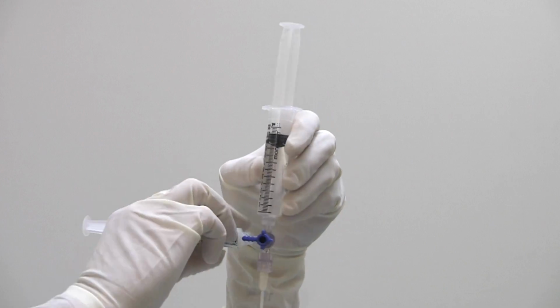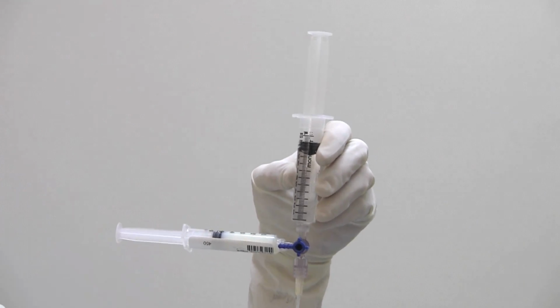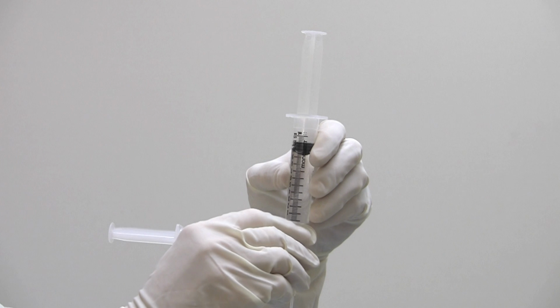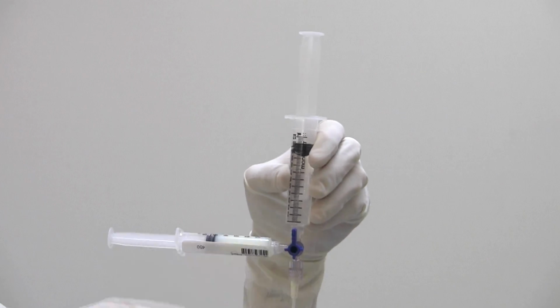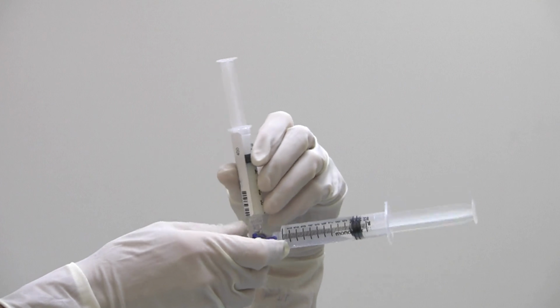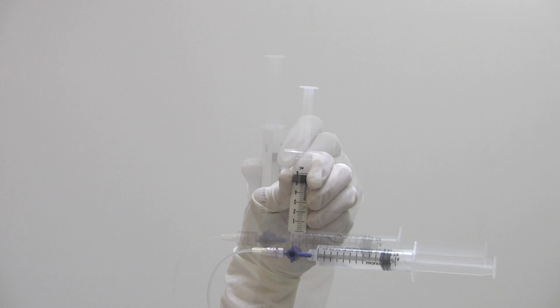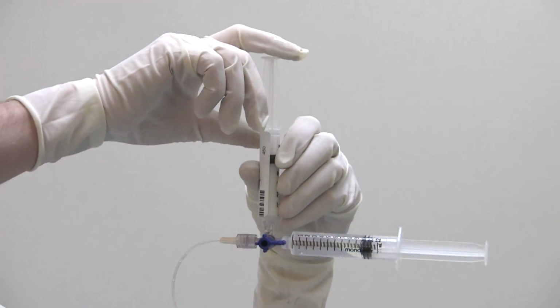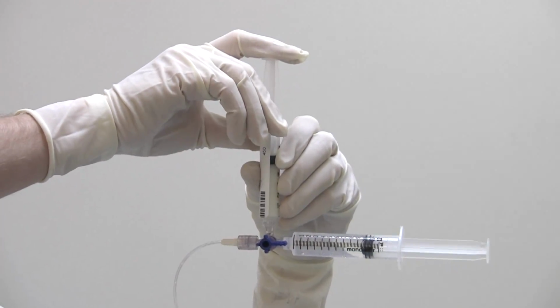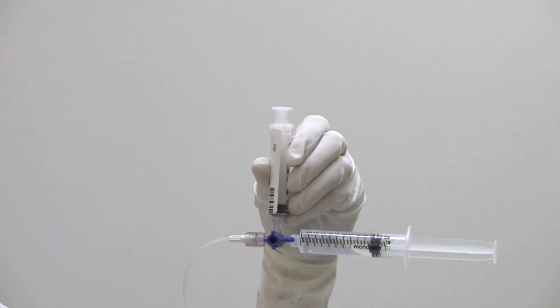With the stopcock in the off position, attach the chemotherapy syringe. Rotate the stopcock so that it is open to the reservoir. Rotate the entire apparatus to reduce air entry into the system. Tap the chemotherapy-containing syringe twice. Administer the chemotherapy slowly over 2 to 3 minutes. No resistance to flow should be encountered.